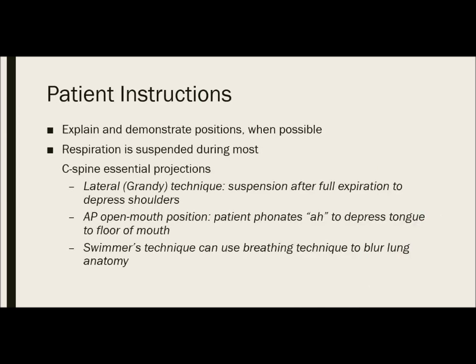Some patient instructions: we want to explain and demonstrate our positions when possible. We especially want to make sure that we're explaining to them what type of breathing instructions they do throughout some of the different projections to make sure that they do them properly. Now, respiration is suspended during most of the cervical spine essential projections. The lateral Grandy technique, we do a suspension after full expiration, and the reason why we do that is to make sure that the shoulders are depressed as much as they can.